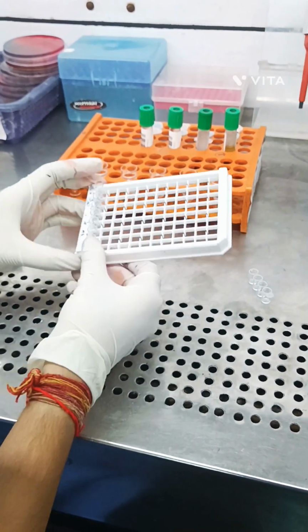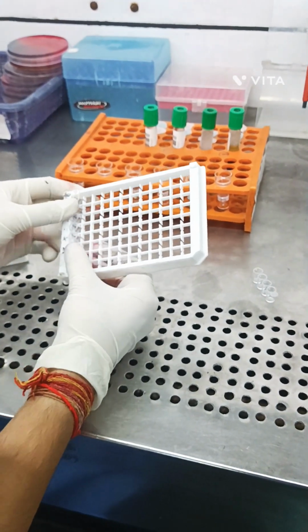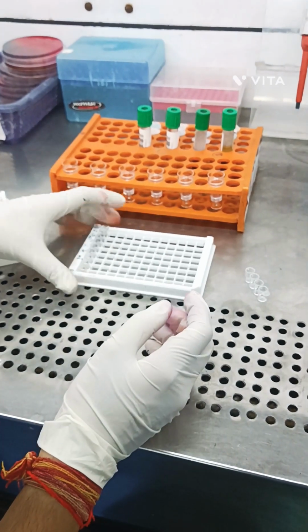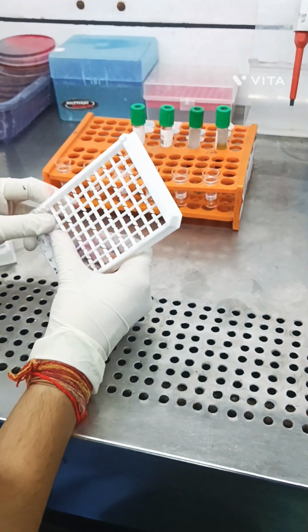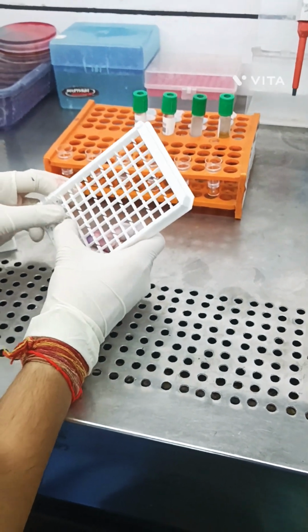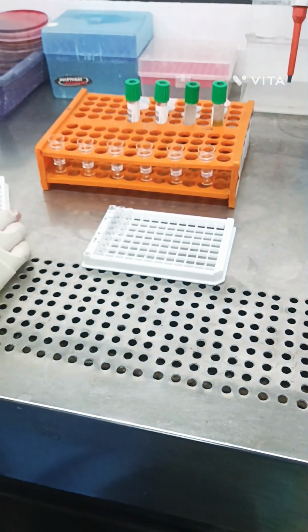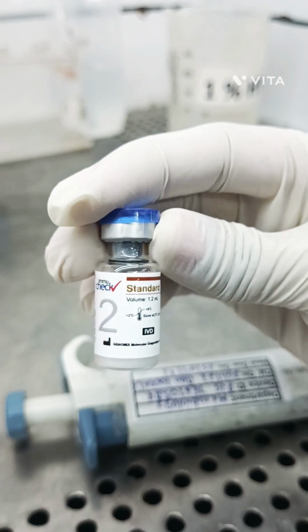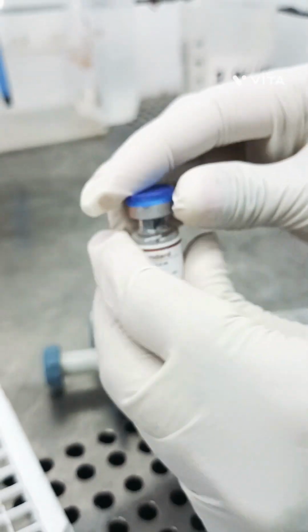So according to this concentration we have to dilute the standards, and first we have to count the samples, and then according to the samples break the wells and set them in the microplate. So we have 6 standards and 4 samples, so for 6 standards, 6 wells we have taken, and 4 for samples.